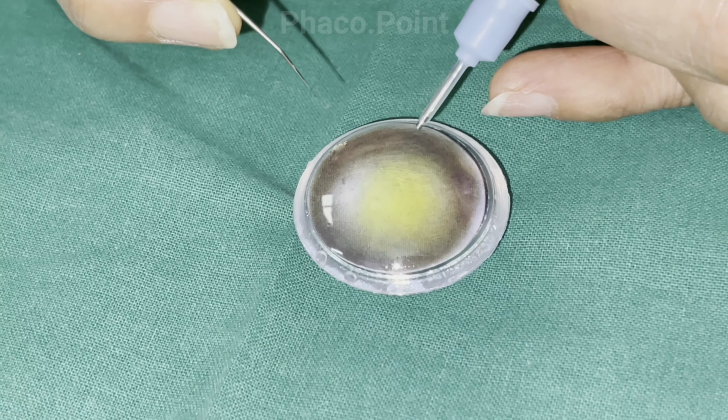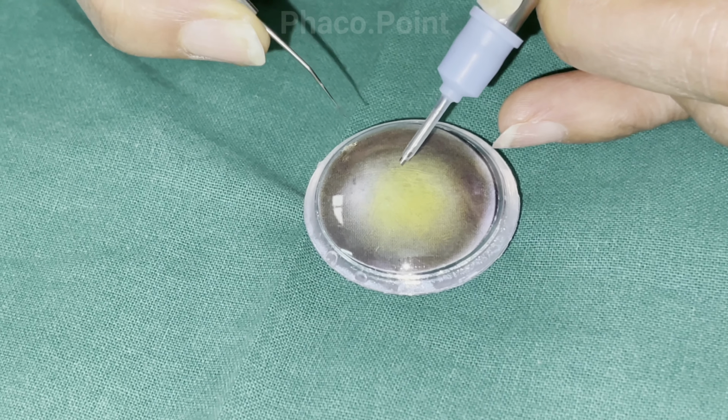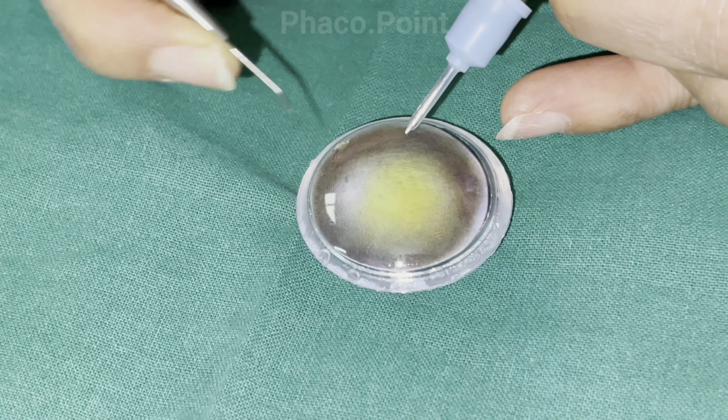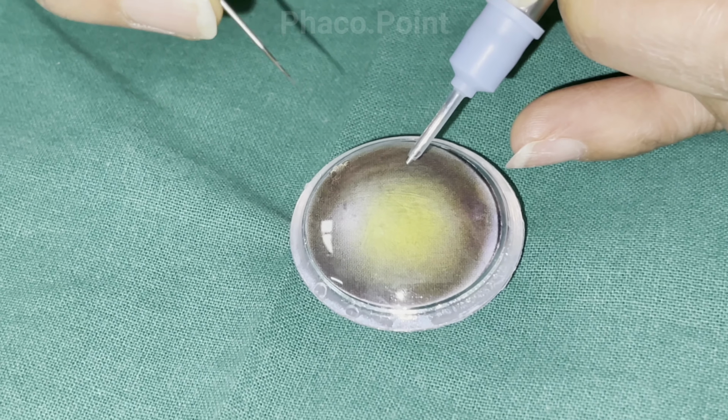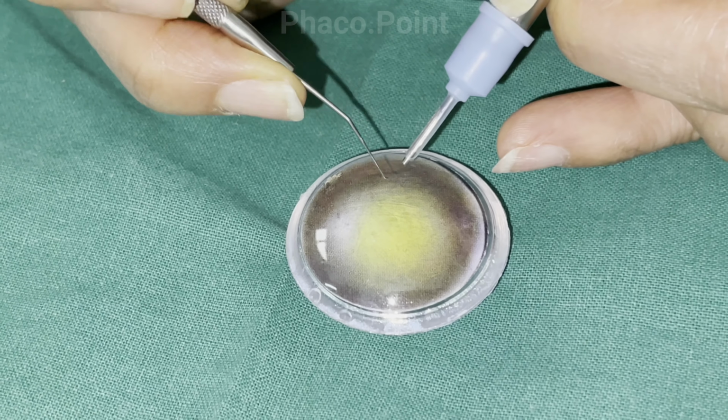So 3 to bury, 2 to hold, 2 to confirm fixity, 2 to bring up, back to 3 to emulsify, and 1. So 3, 2, 3 and 1.